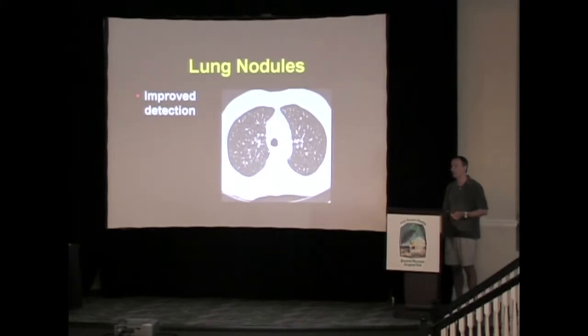In terms of lung nodules, obviously you want to know whether someone has one or more nodules, particularly if you're planning something like resection of a metastatic lesion, if it's a sole metastasis, for example. And just giving you an example that, as I talked about yesterday, we do tend to miss nodules, and it surprises people because we seem to detect so many in radiology.